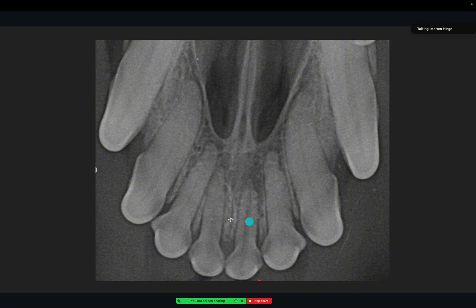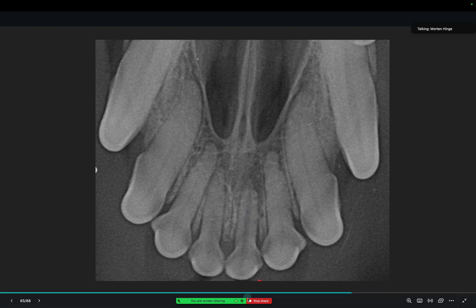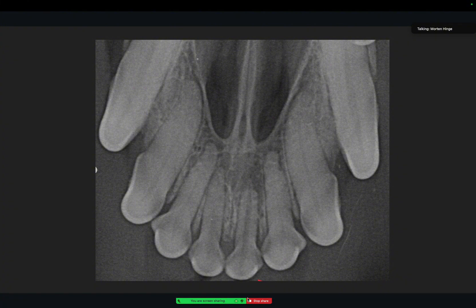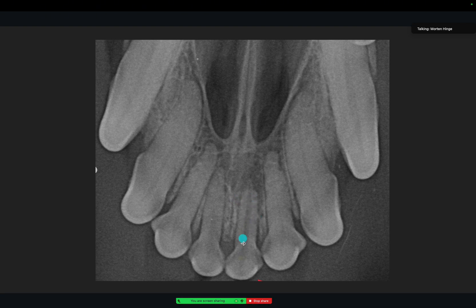When you have an incisor you are in doubt about, look at the pulp chamber or pulp canal width. This one is definitely wider — this dark line here is wider than this dark line here — it means that this tooth is dead. Because throughout the life of a tooth, the pulp canal will get more and more narrow, and if the tooth dies, it will stop narrowing and stay wide while the rest of the teeth get more and more narrow. That's the way you can tell the difference — this tooth is dead.